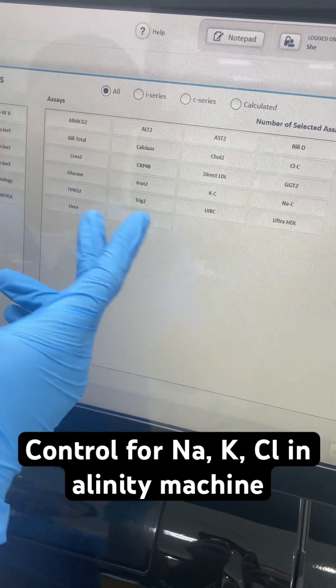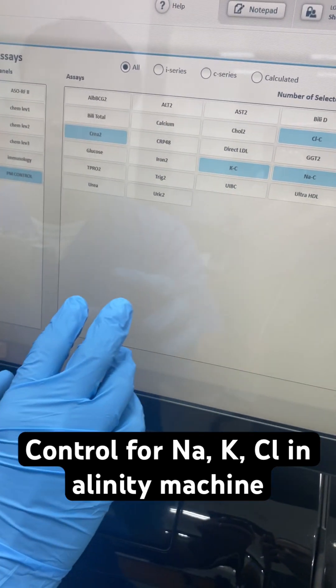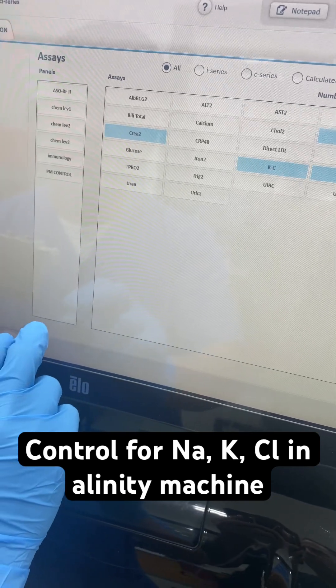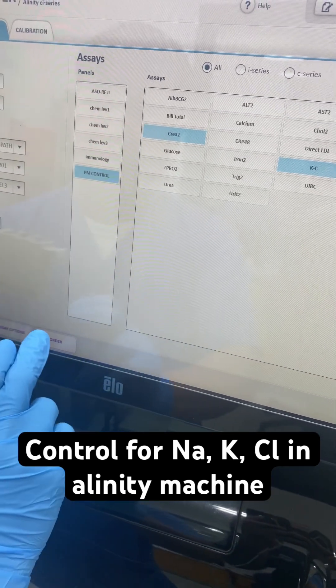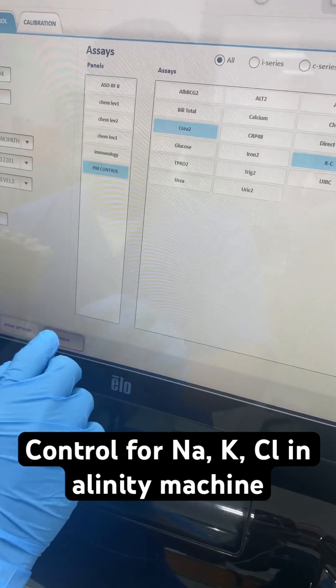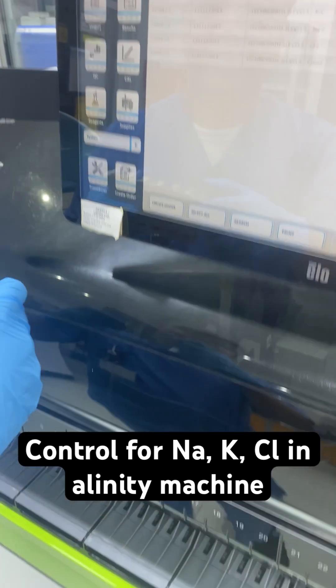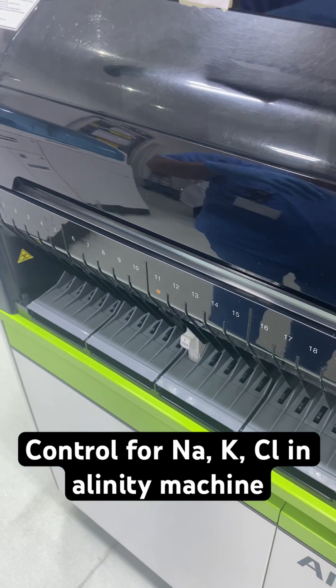Here we program PM Control, which gives you the four tests. Select the level and click Add Order. Click PM Control for level 3 on position 2. And that's it — load the rack and wait for the result.